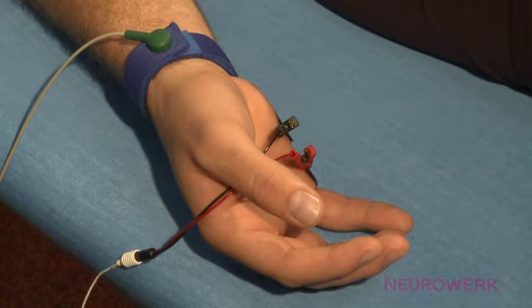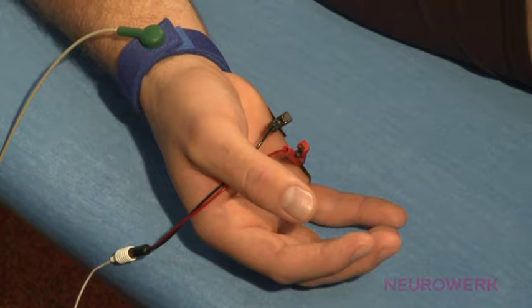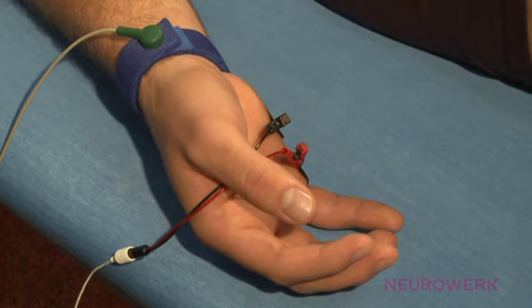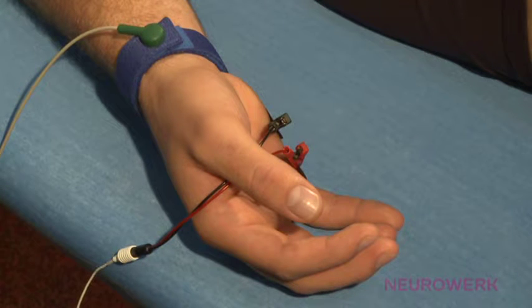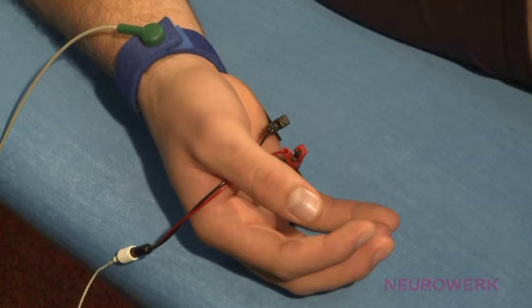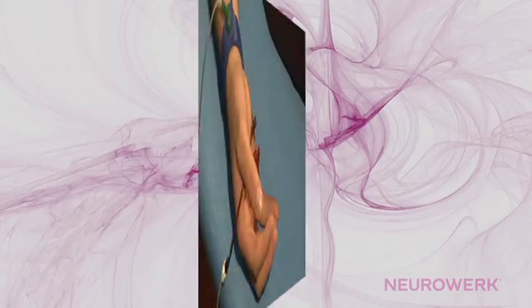The recording electrodes are placed on the target muscle, as is the case with motor neurography, by using the belly-tendon technique. This means that the active electrode is set over the muscle belly and the reference is attached to the tendon insertion. The ground electrode should be large and placed close to the recording electrodes.